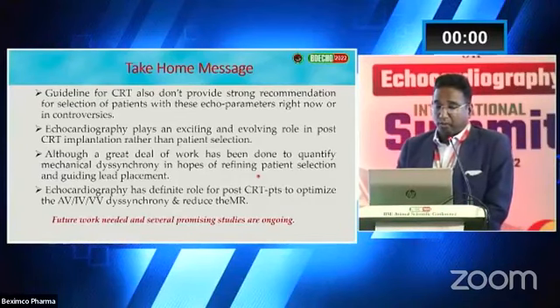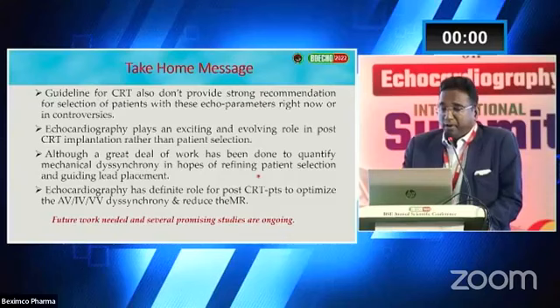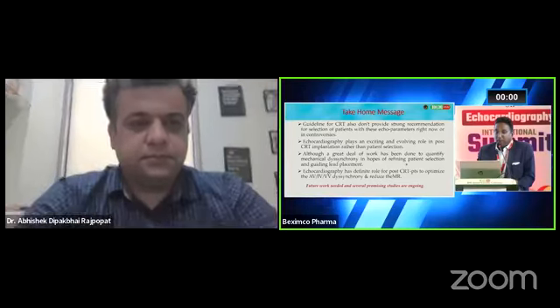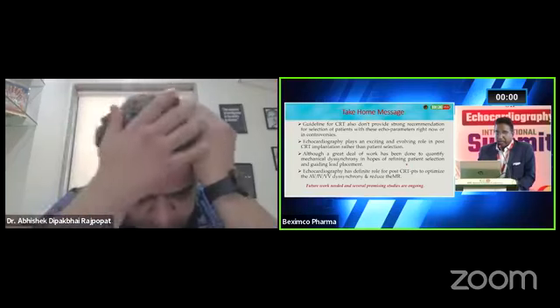do not rely on echo for selection of patients alone. There is an exciting and evolving role in post-CRT implantation rather than patient selection. Although a great deal of work has been done in the hope of refining patient selection and guiding lead placement, echocardiography has a definite role for post-CRT patients to optimize the atrioventricular delay and reduce the MR, mitral regurgitation.